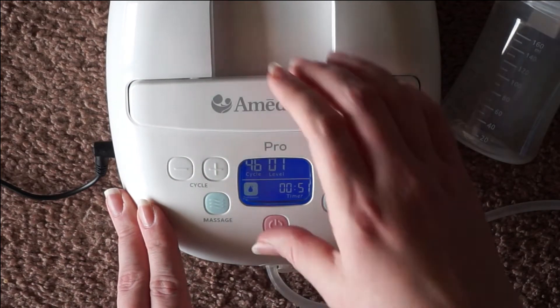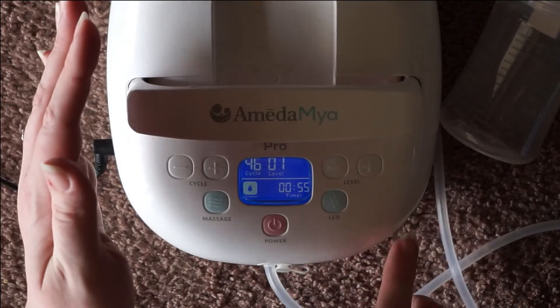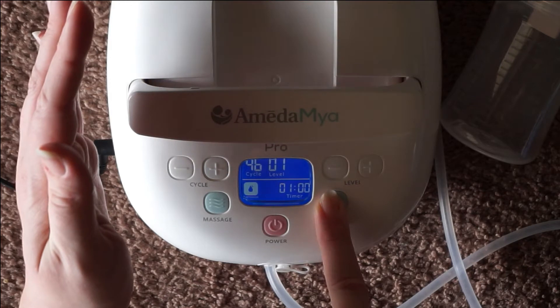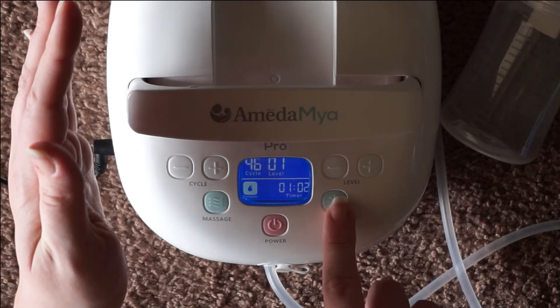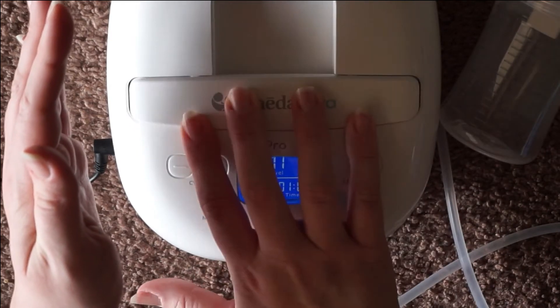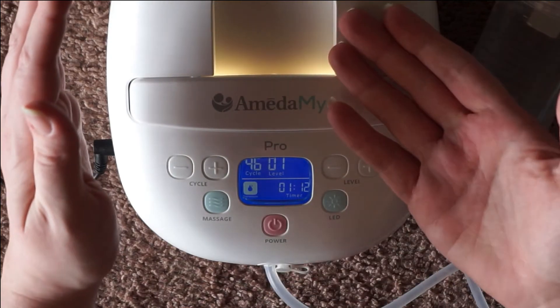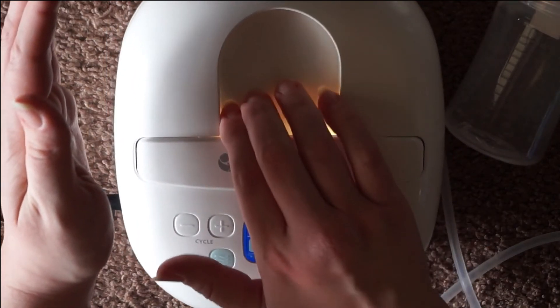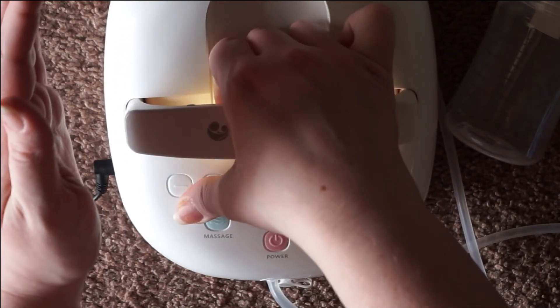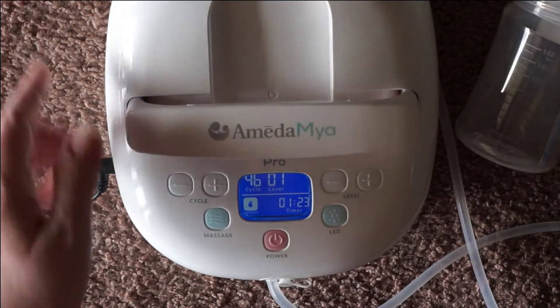I also wanted to mention that the night light is actually underneath your handlebar. If you go ahead and pop that up, the light is right underneath there. You have three settings and then it turns off, so you're just going to have to work through the settings to turn it off if you accidentally turn it on. It does show up a little bit with the handle down, but if you want the night light at full effect, I would recommend popping up the handlebar.